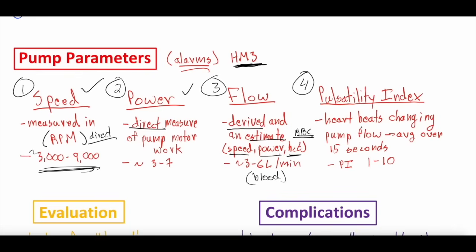The pulsatility index is a little more complex, right? So as we mentioned, the heart is still beating. As we mentioned, I'm going to do this terrible drawing over and over again for some reason, right? You have your LVAD coming out of the left ventricle, going into its inflow tract, into the motor itself, which is then going into the outflow tract, which is then going into the aorta.